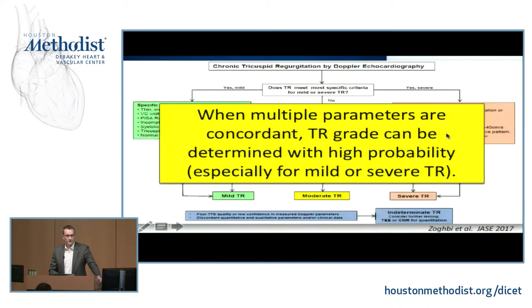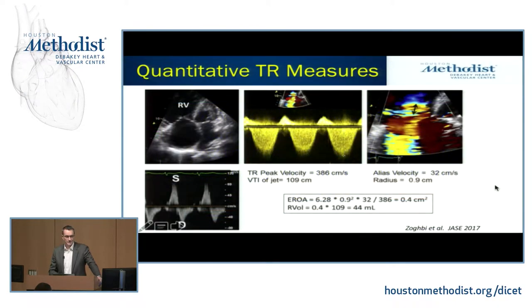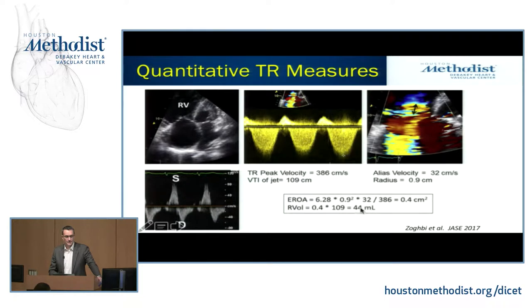Here's an example case: RV dilation is present, there's a CW signal, a measurement of flow convergence radius which you plug into the EOA formula, and hepatic vein flow showing systolic flow reversal. This example shows a huge EOA and a fairly large regurgitant volume.